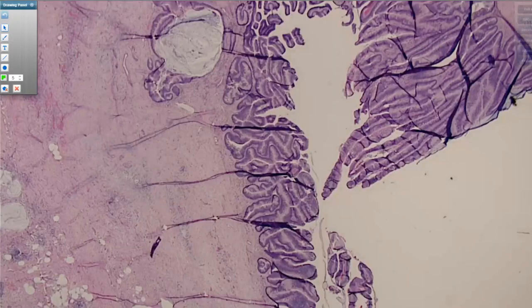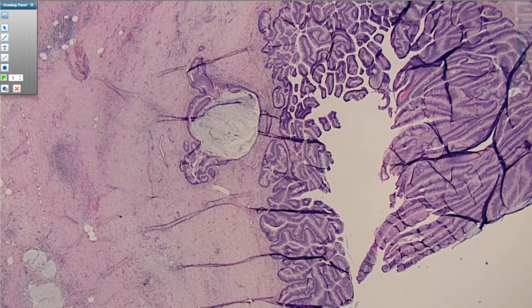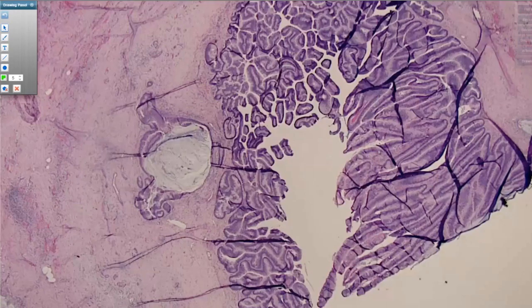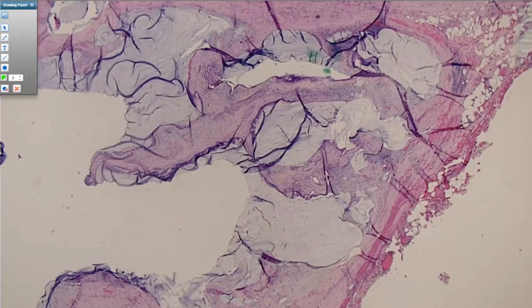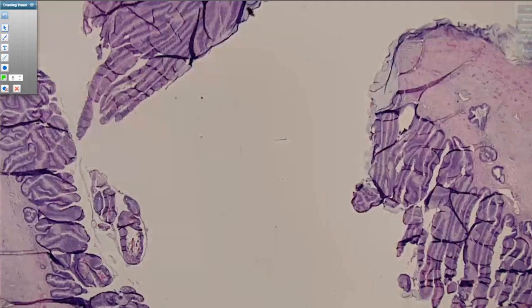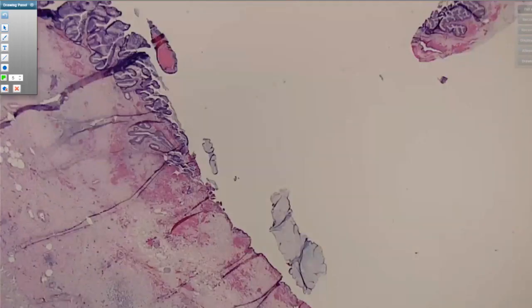2 would be perineural invasion. So one of these mucinous glands, maybe it's some of your incompletely lined extruded mucin. If that's involving a nerve and there's epithelium with it involving a nerve, that's diagnostic invasion. Or if you see pools of extruded mucin with neoplastic epithelium truly floating within it. That's different from seeing extruded mucin that's lined by epithelium, which could also be consistent with a ruptured duct. I'll show you examples of what we really mean by truly floating in the mucin. I think you'll be able to see how that's different from these areas that make you very nervous, but maybe don't have anything definitive to hang your hat on in terms of invasion.